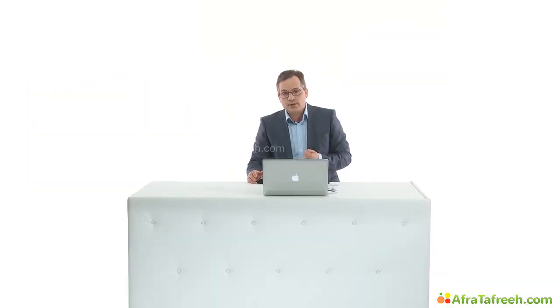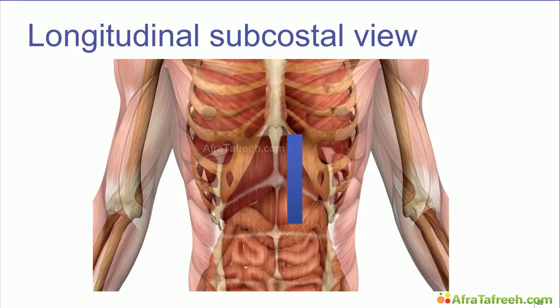First, I show you in theory how to perform the scan, and afterwards we will see it scanning the model. First, we use the longitudinal subcostal view. Now, place the probe in the longitudinal direction at the midline of the patient and make sure to keep in contact with the costal margin. Transfer the probe longitudinally along the costal margin to the right side of the patient, and on the screen follow the inferior border of the liver for the scanning. Now let's go and scan the model. We will repeat it once more.